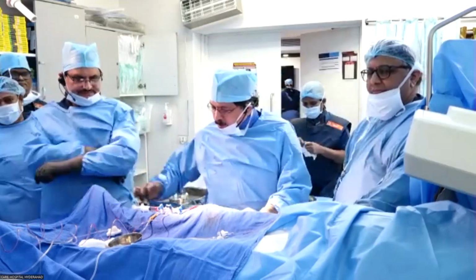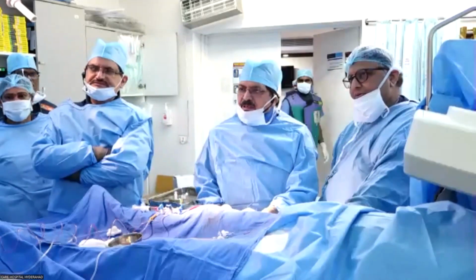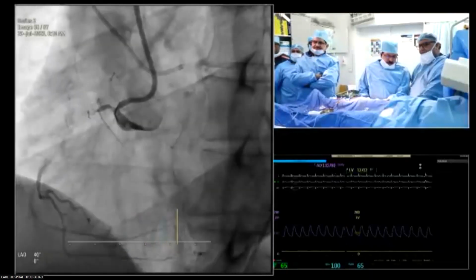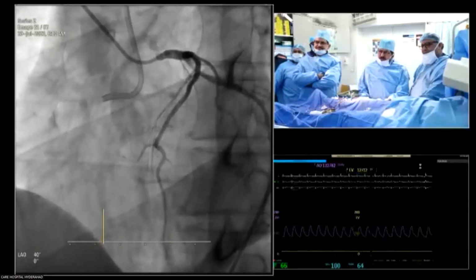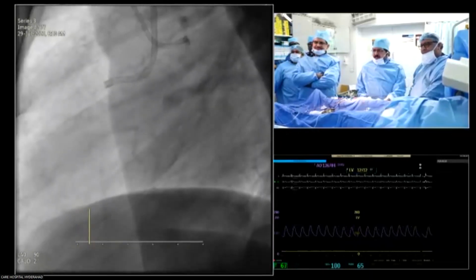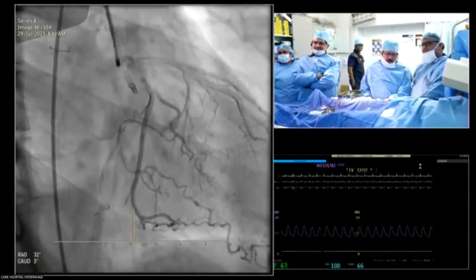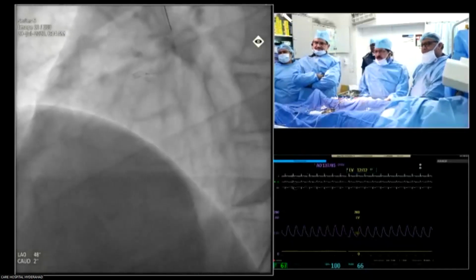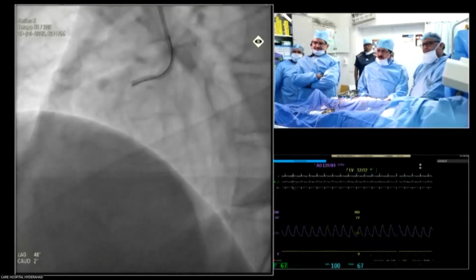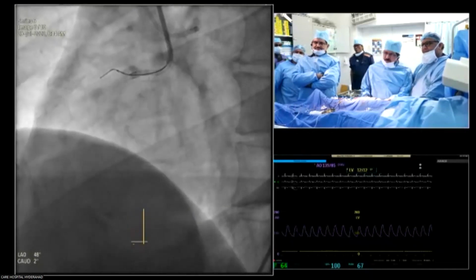Dr. Kalla, can I go ahead and tell something? Yes, sure. This patient had a very small stump. We see a little lower origin of the RCA. Guiding support is a real problem. I took a radial for this short segment. I thought it was a short segment on the CT. My colleague must have shown some calcium specks, but it looks more than 20 mm. And there's some calcium on the IVUS, I will show 270 degrees of calcium. Support is a real issue, but I took a radial only, with the AR. Usually I use AL, but in this case, with the RCA facing down, I took AR1 with side holes. And this is done with a Fine Cross microcatheter with 6 French, and a 2.5 balloon trap is comfortable.